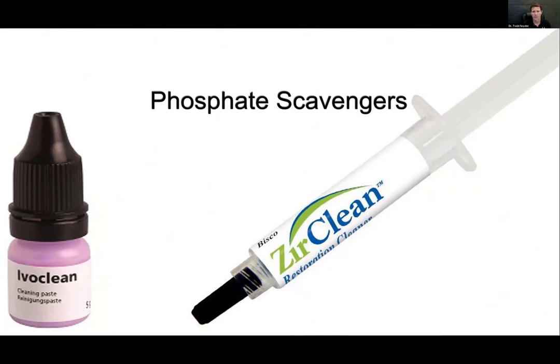Now, what is the big difference here? You tried in ceramic in the tooth, instead of just hitting it with a steam cleaner or an ultrasonic water bath. In this case, zirconia is special. It has to be handled differently. And this is where a lot of the concern comes in. We've all heard of Ivoclean from Ivoclar. There's also Zirclean from Bisco.